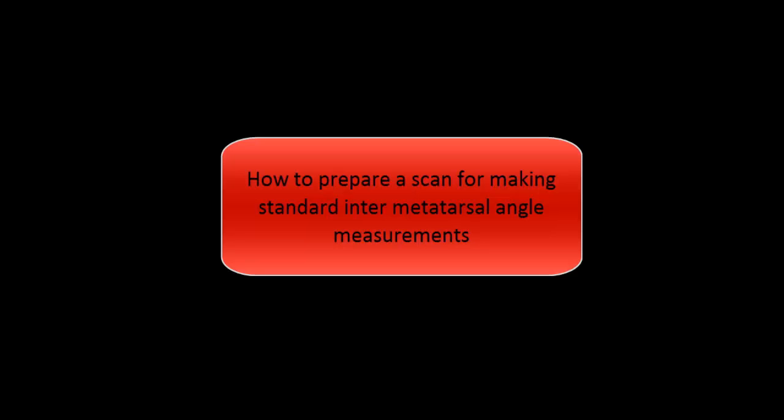In CubeVue software, in order to prepare a scan for making standard inter metatarsal angle measurements, follow these steps.